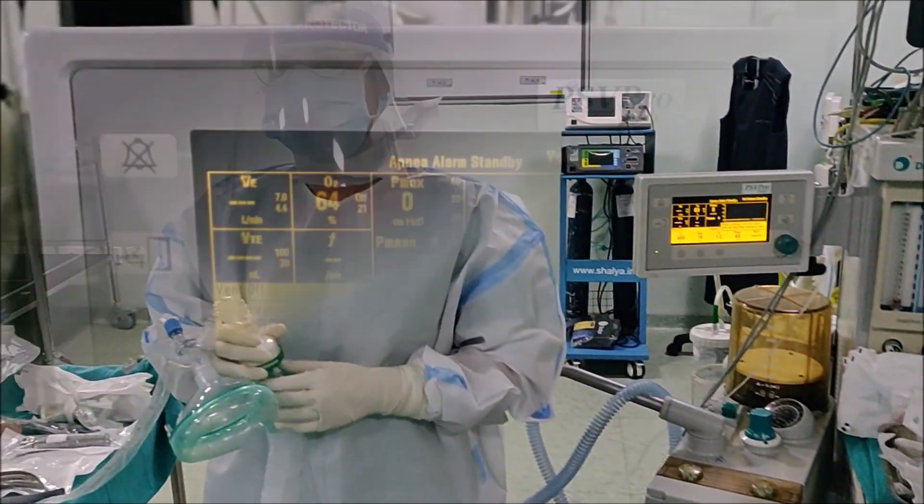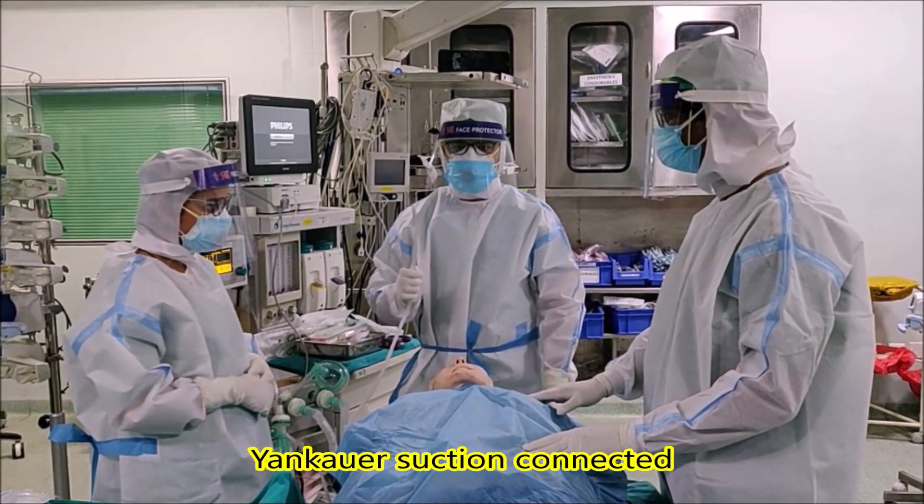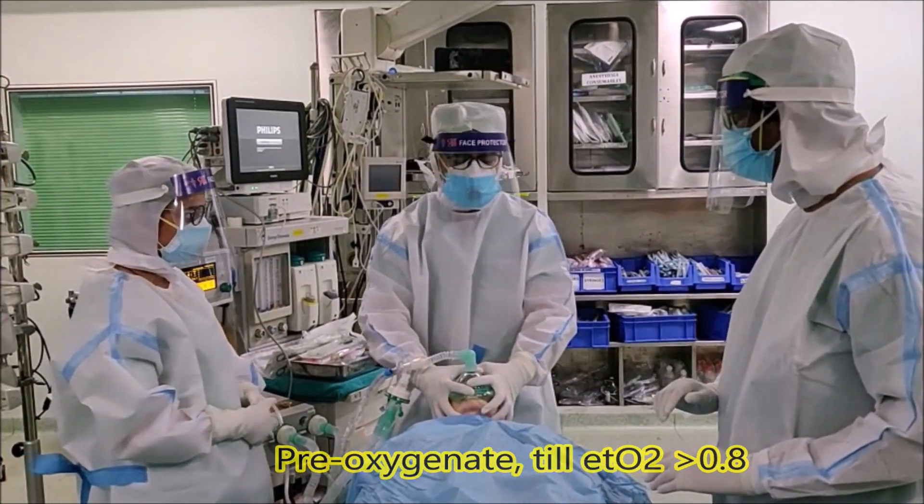Check if the ventilator has been set for this patient? Yes it has. Is the Bain circuit connected? Yes. We can start pre-oxygenation with a two-handed seal. Oxygen on.